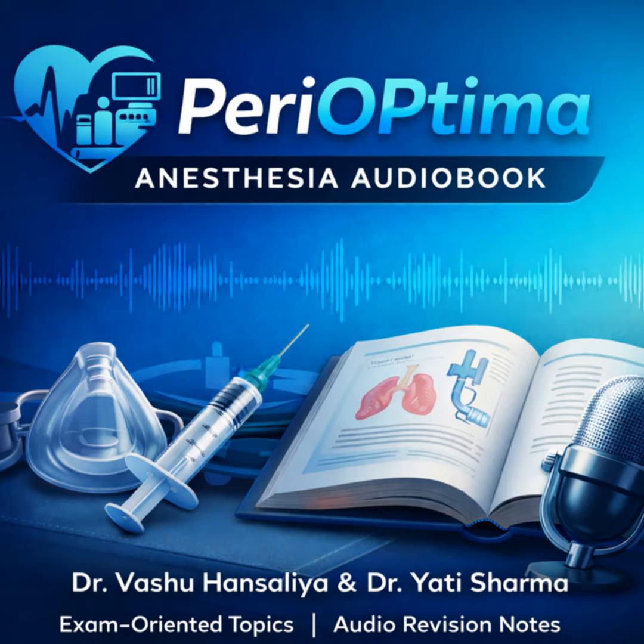That's a powerful trifecta. Okay, I need to drop some specific anatomy names here to show I know my stuff. Let's take the interscalene block. If I'm writing about this, I need to describe the image. The classic. You must describe the stoplight sign. So probe on the side of the neck. I see the anterior scalene and middle scalene muscles. They form a sort of triangle. And inside that sandwich, I see 3 round, dark anechoic circles stacked up. C5, C6, C7. Red, yellow, green. The traffic light. It's a beautiful image.